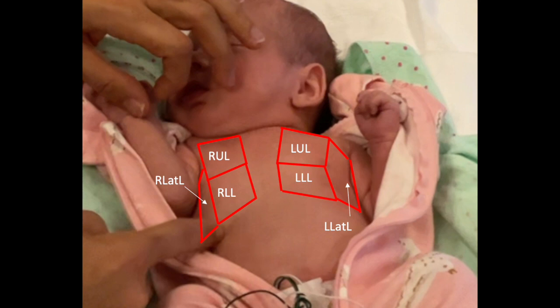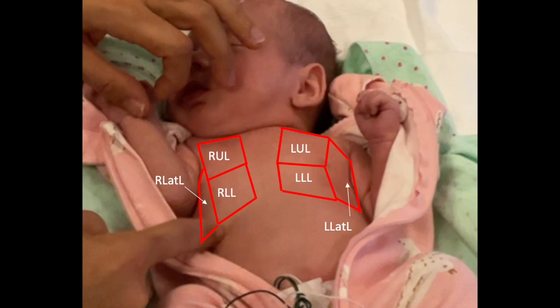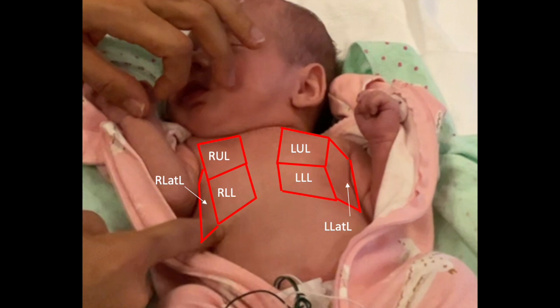For the PURPOSE project, if you are scanning on the contralateral side of the defect, the first ultrasound is in the delivery room and the second ultrasound is performed at around 12 hours of life — you would only do the contralateral chest. For the pre-extubation ultrasound, you would do both chests, meaning all six zones. You would also acquire an M-mode in each of these zones.